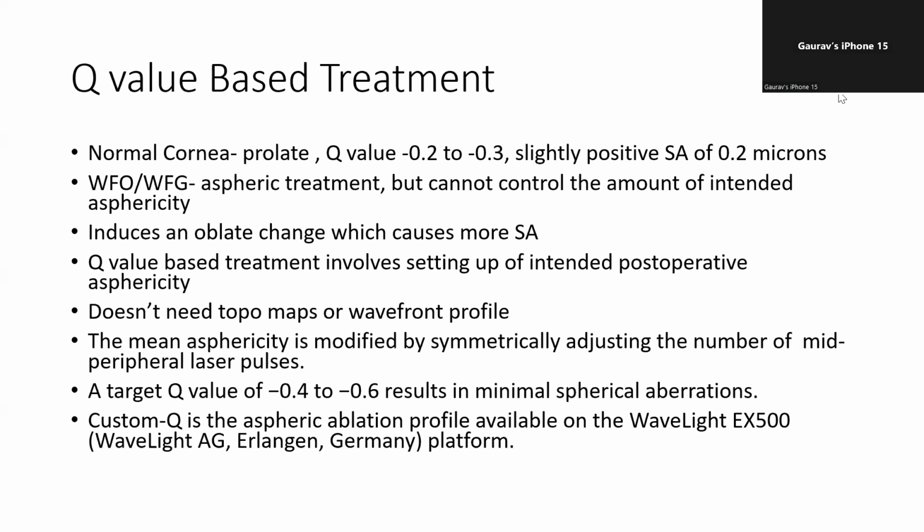What is the full form of FCAT? Fine customized aspheric treatment. All right, FINE. It allows customization of many things, including optical zones in steps of 0.1 and lots of other things. So obviously you can customize the Q value, the target Q value can be fed in it.